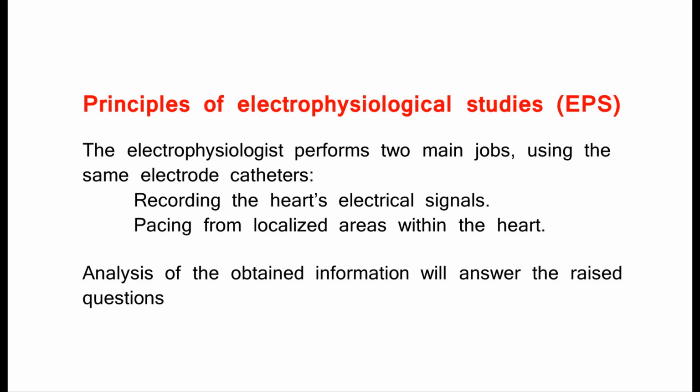Principles of Electrophysiological Studies, EPS. The electrophysiologist performs two main jobs, using the same electrode catheters: recording the heart's electrical signals, and pacing from localized areas within the heart. Analysis of the obtained information will answer the raised questions.